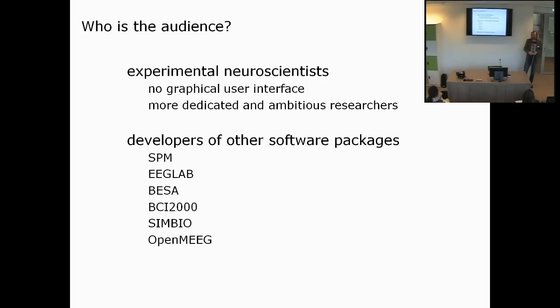But FieldTrip also targets the developers of other software packages. So we have been working together with the SPM team for quite some years now, also with EEG Lab. In a few weeks from now, I'll also be giving an EEG Lab workshop. EEG Lab is one of these toolboxes that capitalizes on the graphical user interface. It really shows you the data at all steps of the analysis. And I think that makes it valuable for a certain type of users.